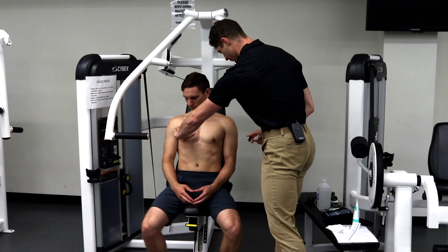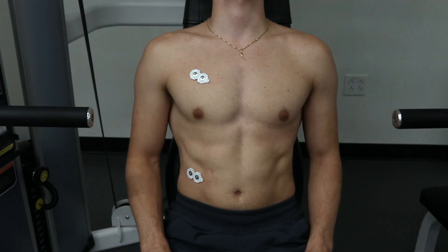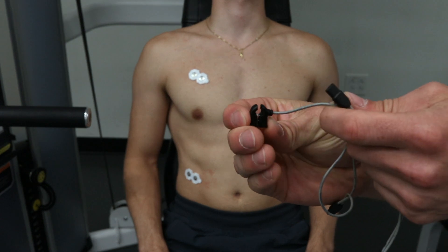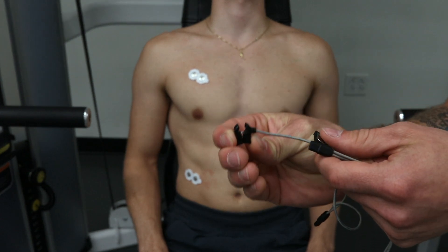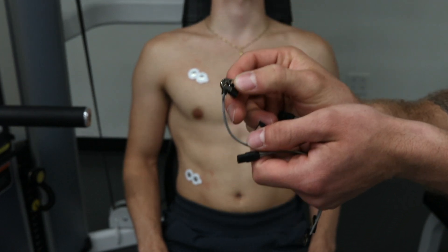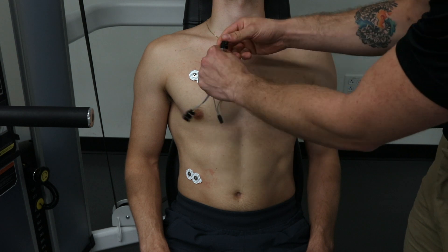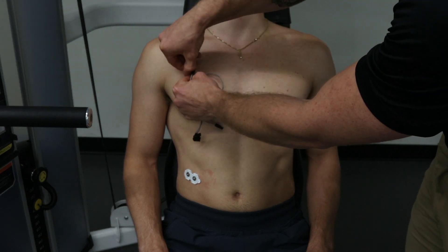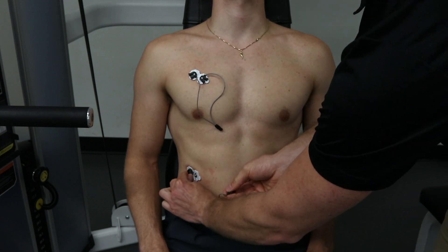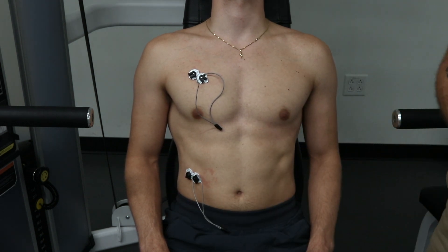We'll apply our hexagonal electrodes on the points we saw on the 3D muscle map — the pec major and the external oblique. Now that the electrodes are attached, we can attach our lead wires. To attach the lead wires, take this black clamp, squeeze it down, and open it up so it can attach to the electrode. Make sure the metal backing on the clamp is attached to the electrode facing toward the individual. We'll do that now for the pec — one and two — and the same for the oblique — one and two.